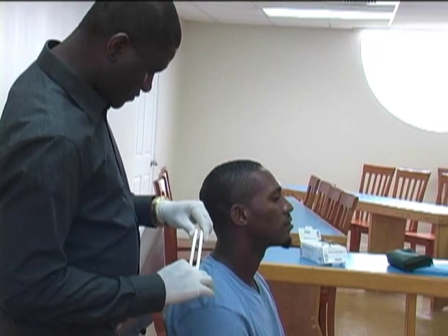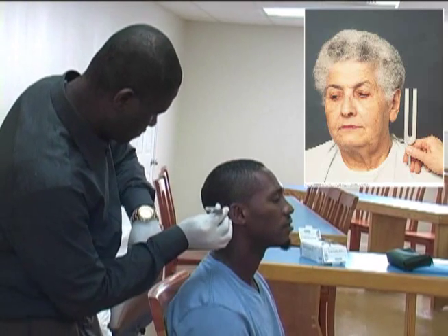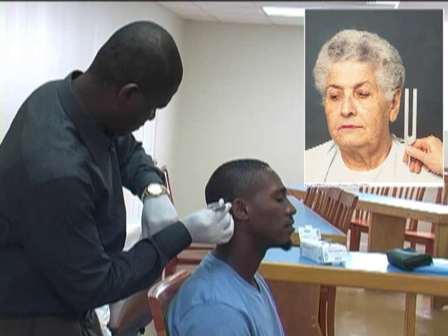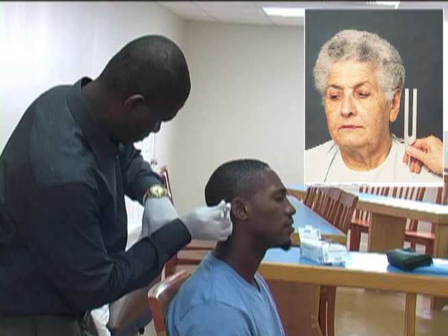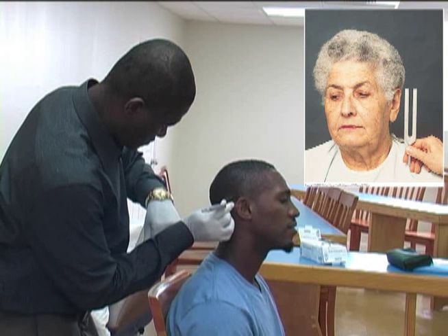Immediately place the still vibrating tuning fork just outside of the ear in line with the external auditory meatus. There should be no contact between the ear and the tuning fork. The tuning fork should be facing broadside forward.